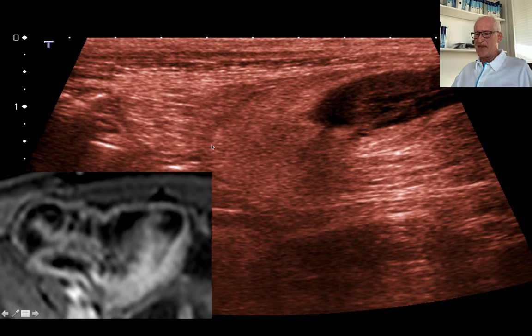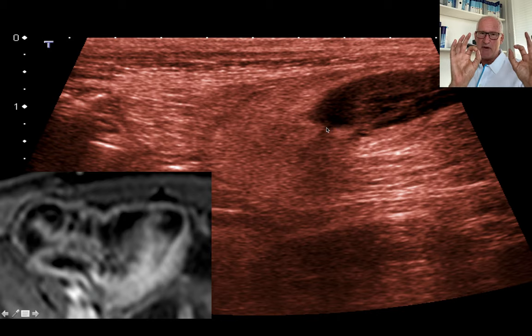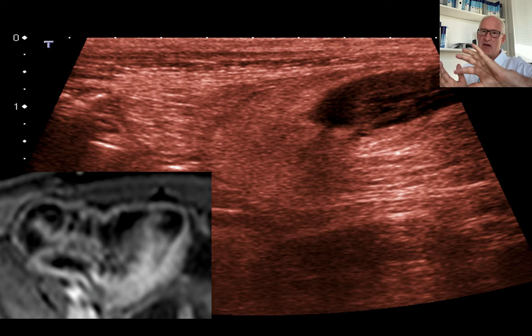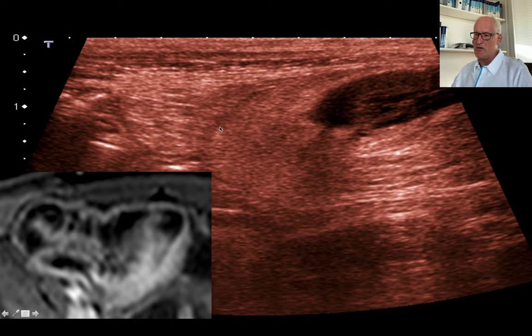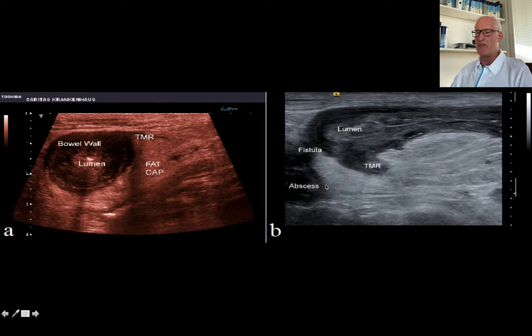We may also see the surrounding structures — fat infiltration, which is typically seen as an important sign in MRI and CT. In ultrasound, it is more the direct sign, whereas in CT and MRI those indirect signs like infiltration of the surrounding are the predominant features. The fat cap, as shown here, the transmural reaction beyond the bowel wall, fistula formation, and abscess formation can all be depicted.